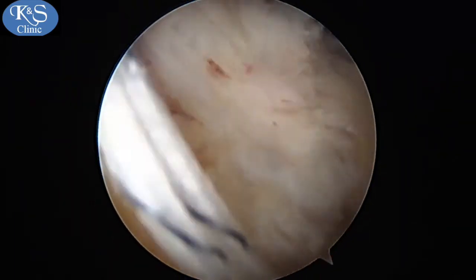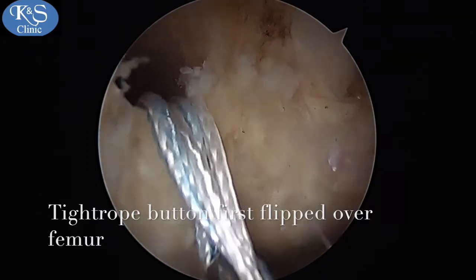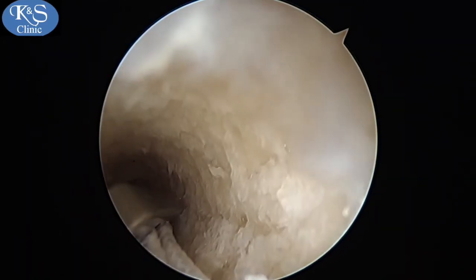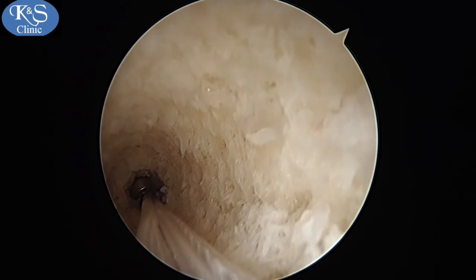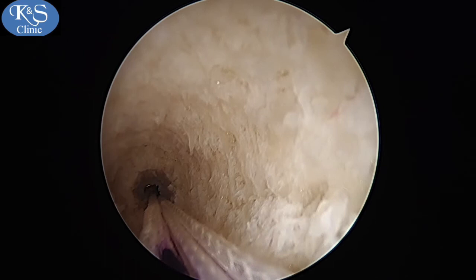Both loops are shuttled into one that comes out to the tibial tunnel distally. Through the loop, the tightrope is shuttled through. Viewing from the high anterolateral portal, I like to see my button flip first. This adjustable loop lets you make the loop length very long so that you can see the button flip first.